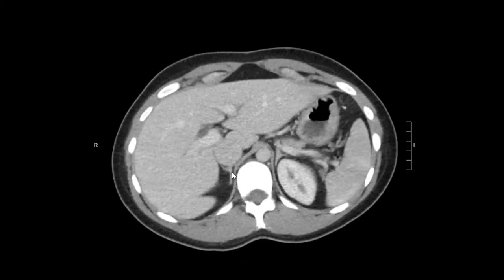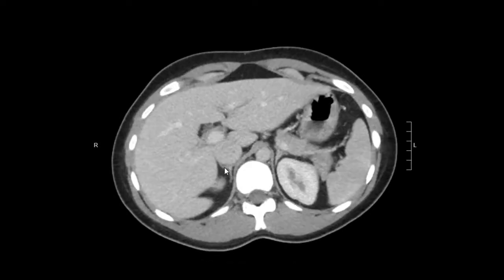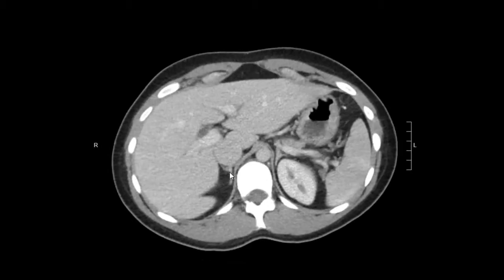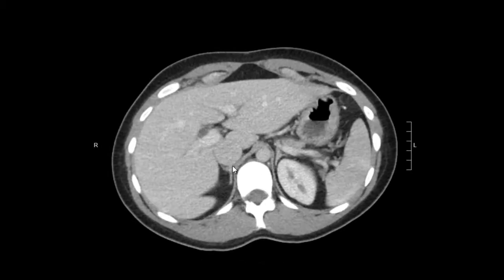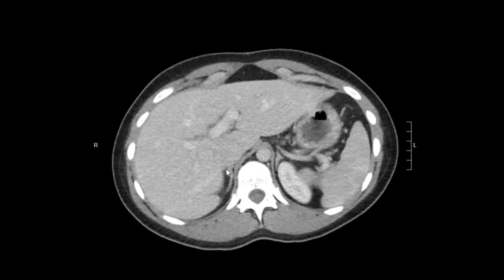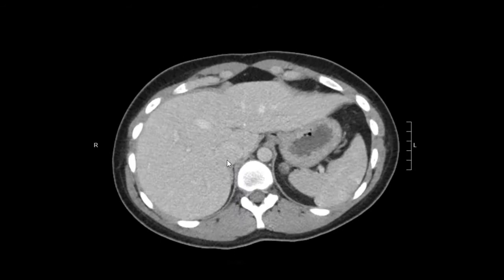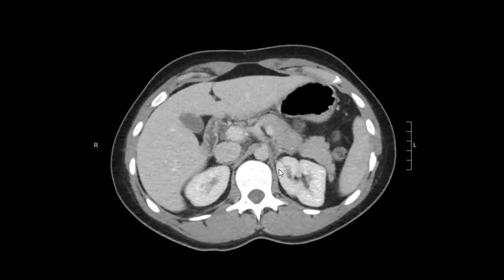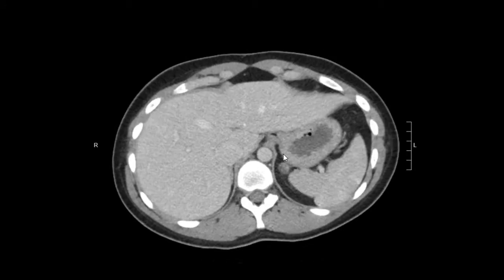Lastly for the solid organs, the adrenal glands. This is the right adrenal gland — it's kind of an inverted V or inverted Y. Here's the base, here is the medial limb and the lateral limb. That's the right adrenal gland. And the left adrenal gland also looks normal.